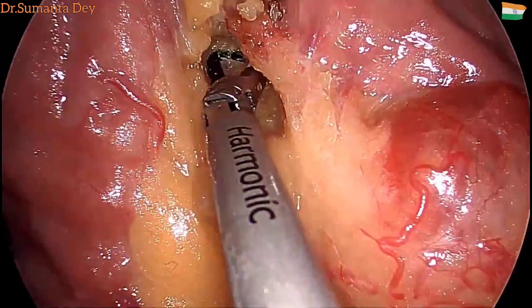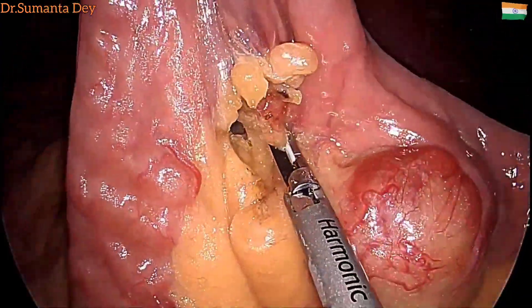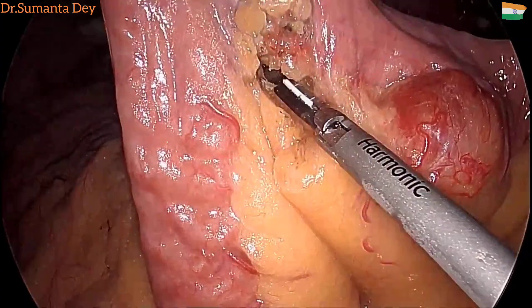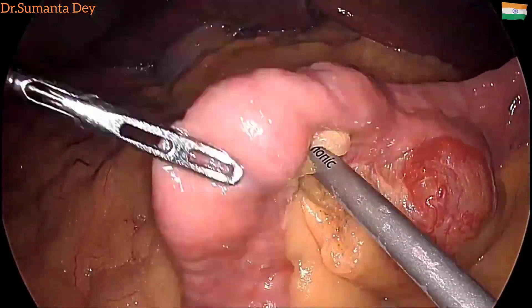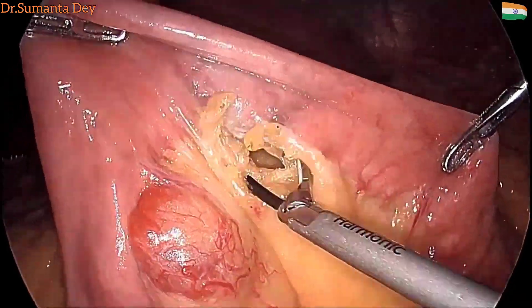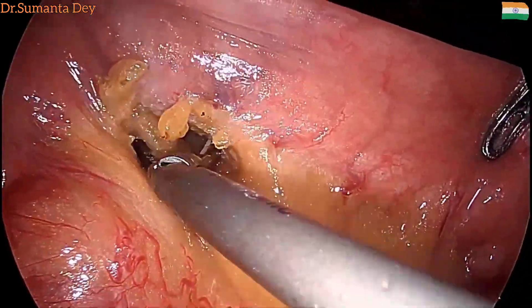As you can see from this image, capsule endoscopy and everything was done, and it was confirmed as a submucosal swelling in the proximal jejunum. So I decided to go ahead with jejunal excision and jejunojejunal anastomosis.